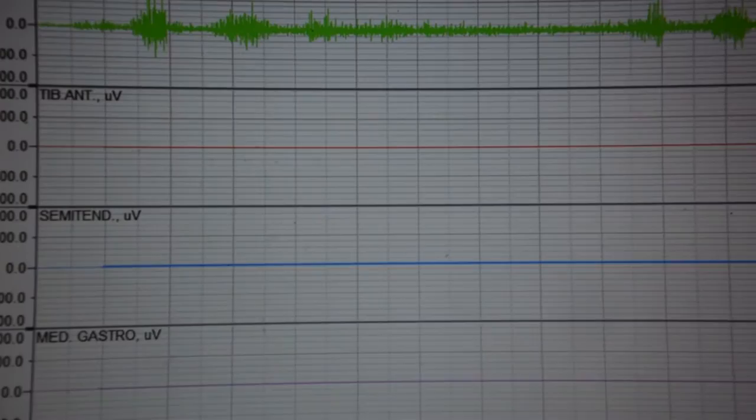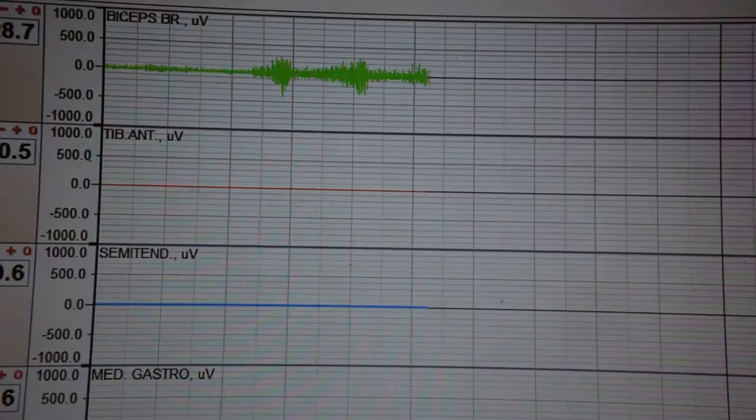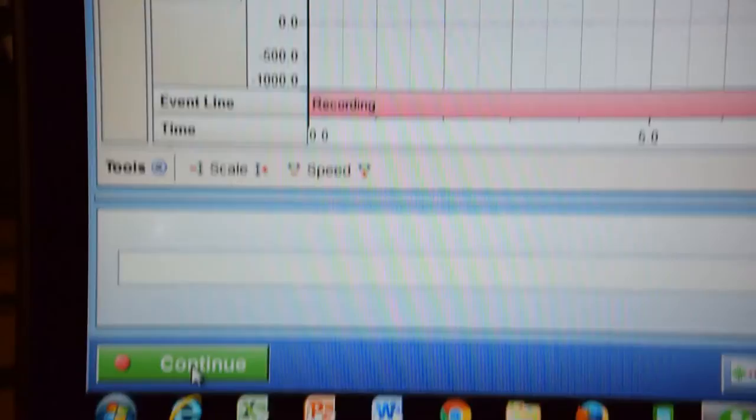Now this is not collecting yet. This is basically showing us that the electrodes are functioning properly. So now what we will do is we will come down and we will click record. And it will say recording. And then you will begin to see your changes in muscle activity there. When we are all done, we will come down and click the finish button.